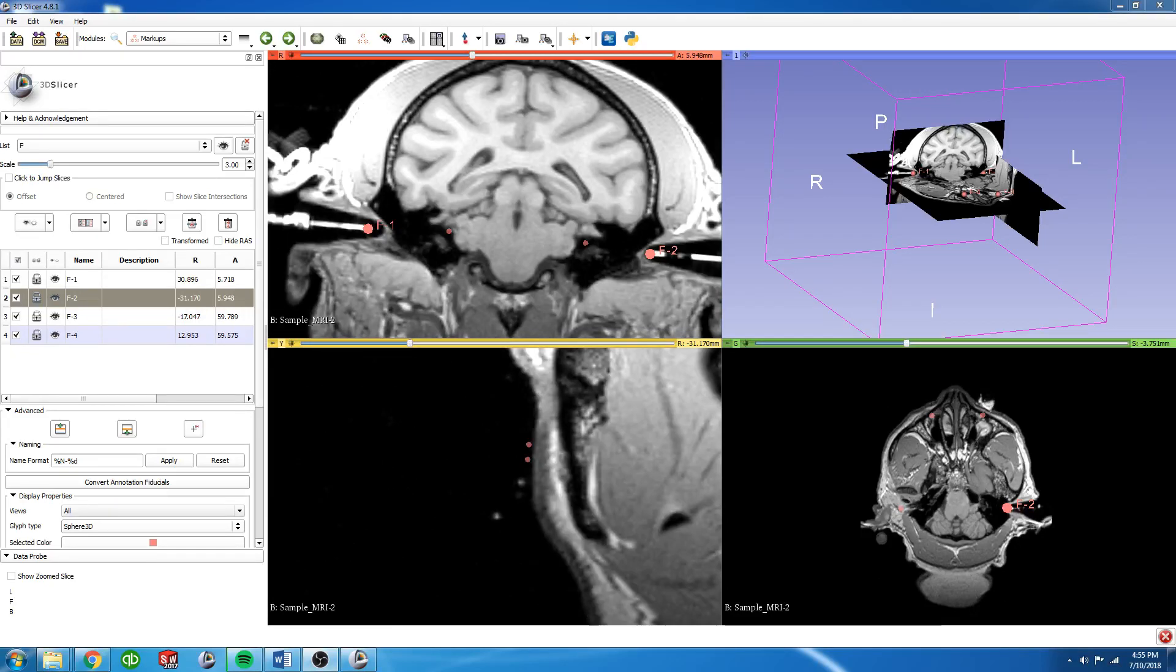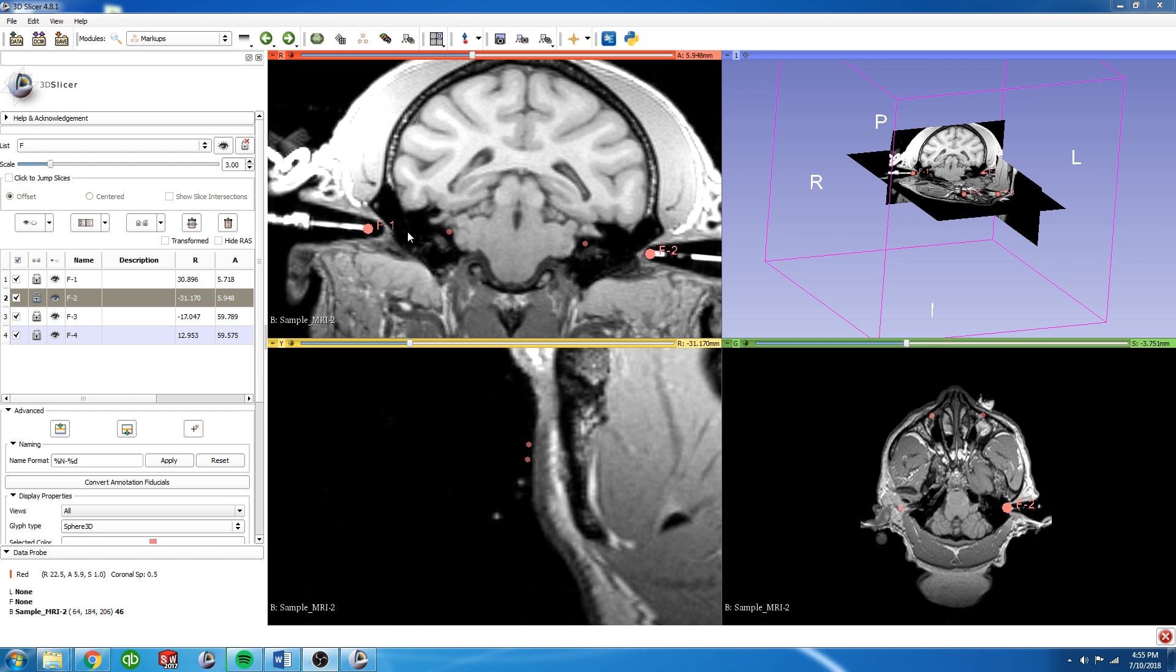So what we're going to do now is try to get this row, this line of fiducials to not be angled as it is right now. We want it to be straight across.